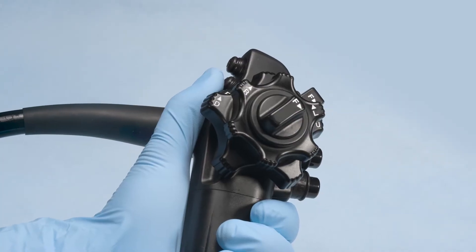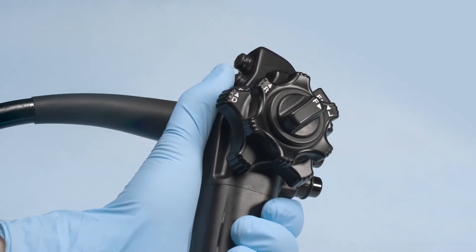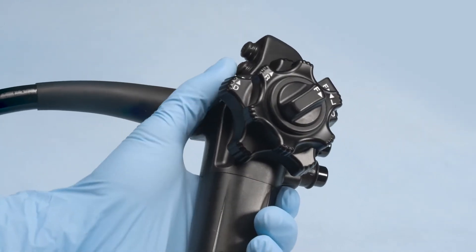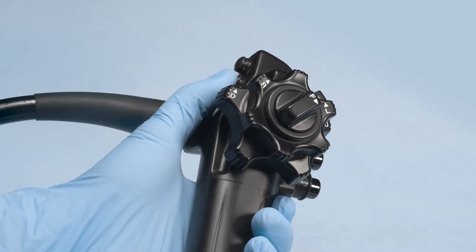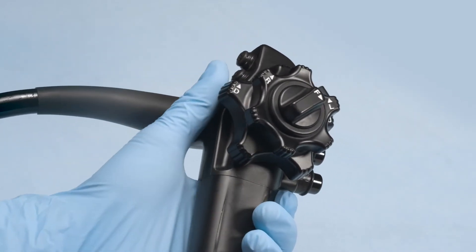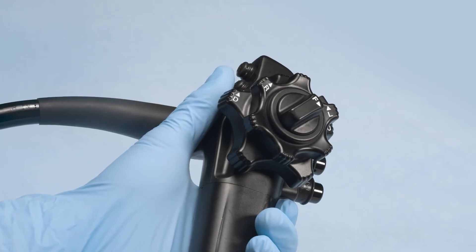Next, inspect the elevator control lever by slowly moving it distally, then return it to its original position. Check that there are no irregularities or abnormalities in the operation of the lever, such as roughness, catching, or that it does not move smoothly.